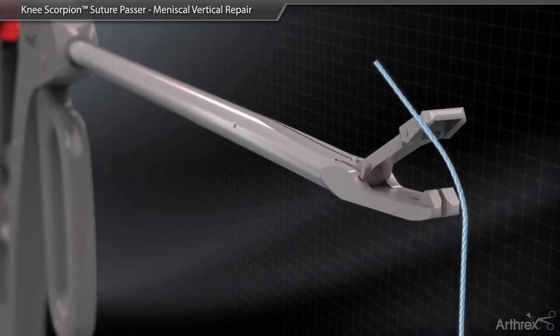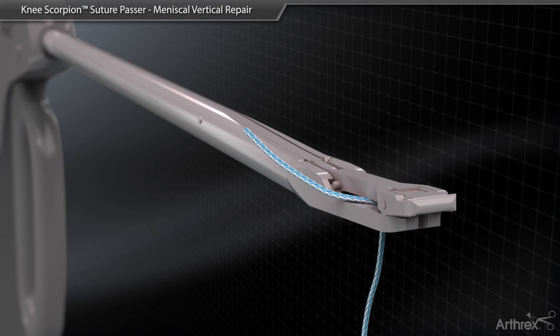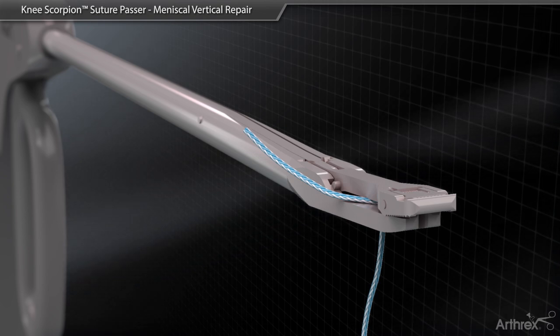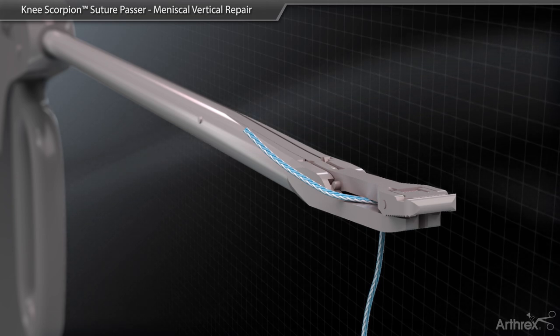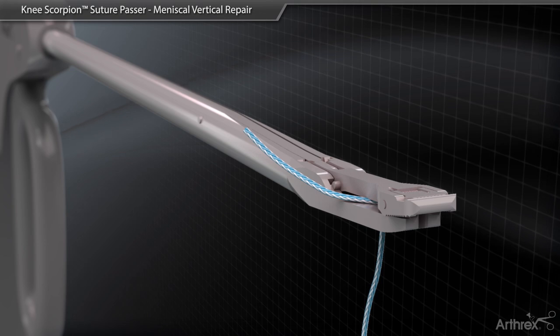Load the bottom jaw of the Knee Scorpion with either 0 or 2.0 fiber wire so that the suture is oriented to the right side of the needle with approximately a 1 inch tail of suture in an upward position.